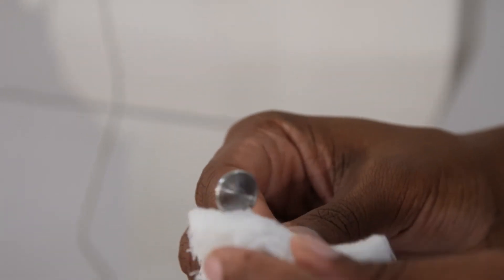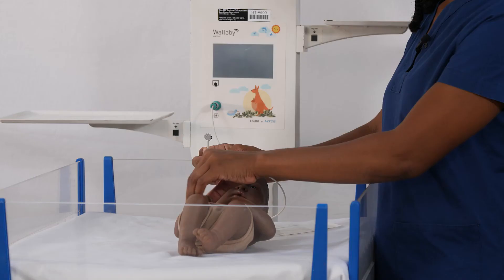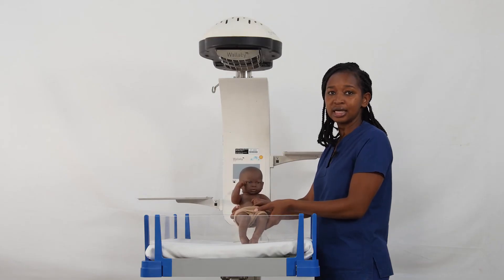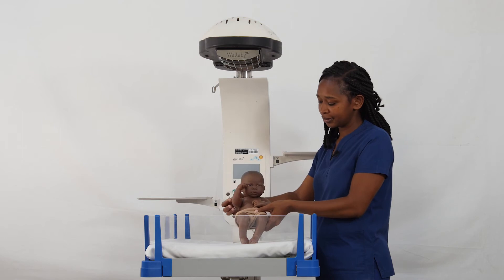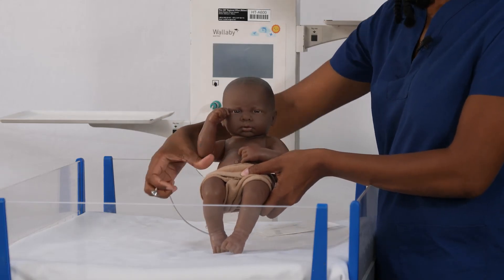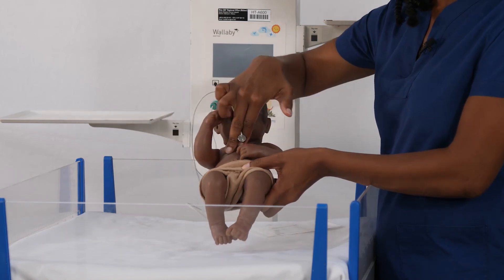Before you place the probe, you need to clean it with 70% alcohol, and the lid as well. The flat side is supposed to be on the baby's abdomen, as the abdomen is considered the core temperature. The probe needs to be placed directly over the liver. You can find the correct place by making an imaginary line from the mid-clavicle downwards to just below the ribs where the liver is located.